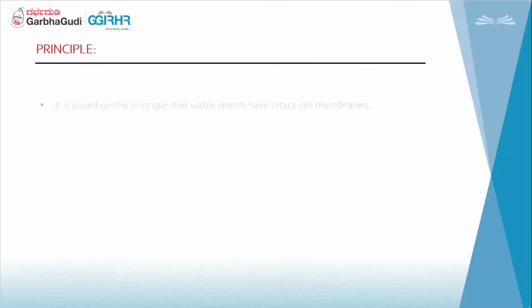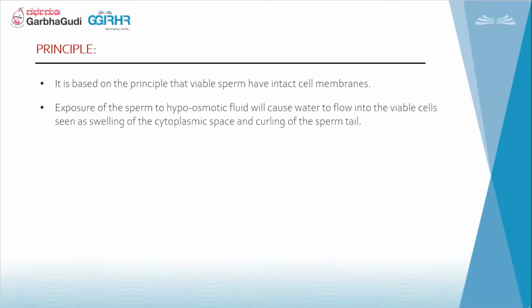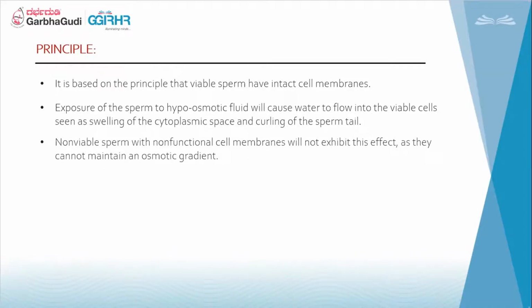So coming on to the principle. Any test we do, we should be thorough with the principle: why we are doing it, how it is working, and how it is useful to us. The test is based on the principle that viable sperm have intact cell membranes.